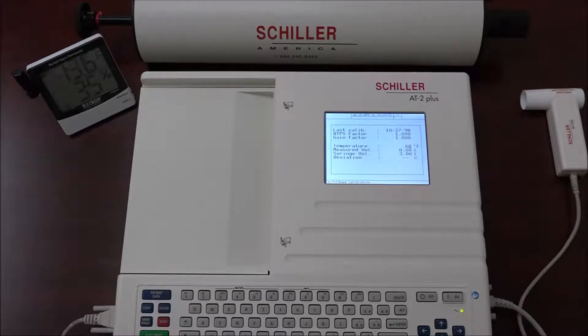Keep in mind that the temperature already in the temperature field is not always accurate. The measured volume is the air volume measured by the system for the calibration pump. Finally, the reference volume is the entered air volume, depending on the size of the calibration pump.